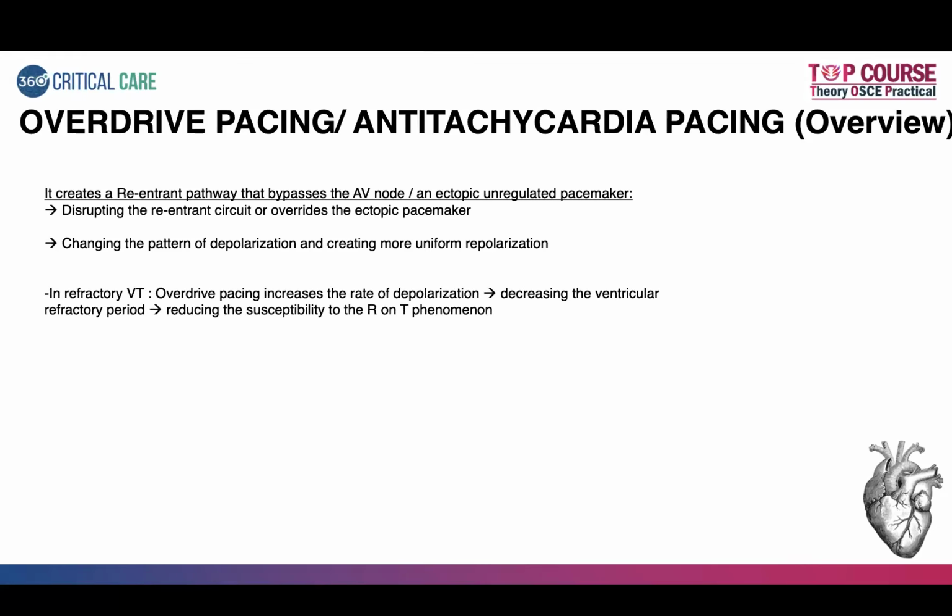The main benefit of it is in patients with refractory VT, like in electrical storm. So overdrive pacing increases the rate of depolarization, thereby decreasing the ventricular refractory period, thereby reducing the susceptibility to R on T phenomenon.